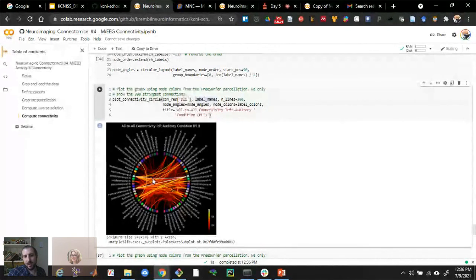Now, I would say this is a bit better. This is on the better side compared to the 3D brain plots that I showed before, and I was ragging on pretty hard. This is not so bad. I mean, you can see there's a sensible way of trying to do this kind of spatially structured network graph visualization. The number of nodes is not too crazy. We're not missing things because there's a third dimension that we're not really seeing properly.